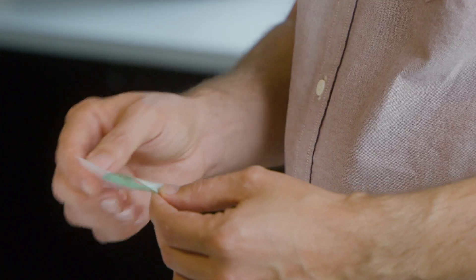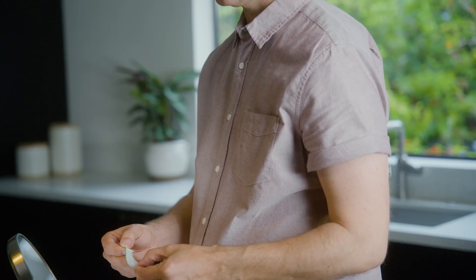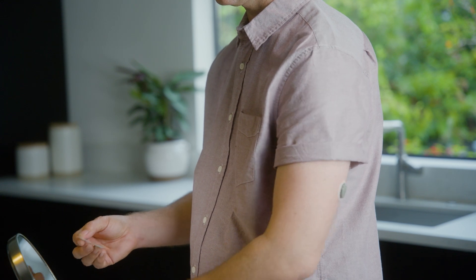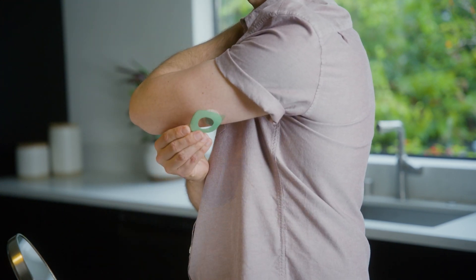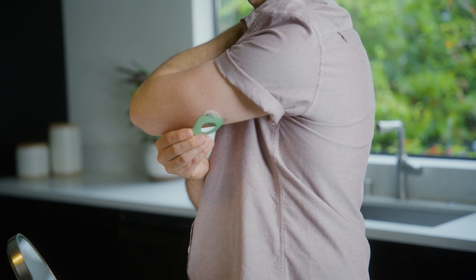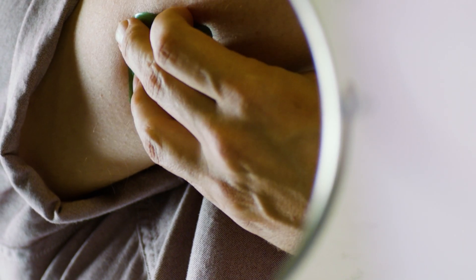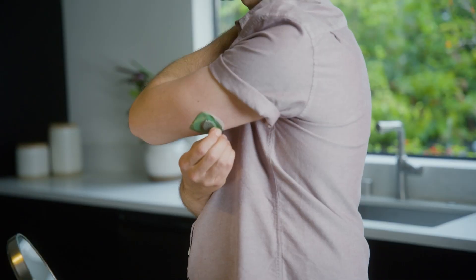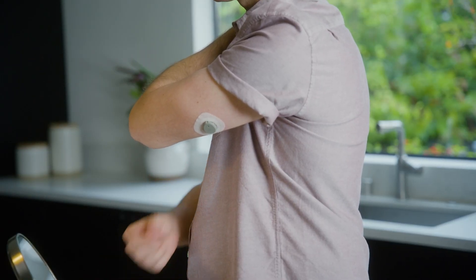To apply the overpatch, first carefully pull off both clear liners one at a time. Be sure not to touch the white adhesive area. Use the tab to place the overpatch around the sensor — you may need to look in a mirror for this part. Once on, rub around the overpatch. Then, use the tab to peel off the liner and rub around the overpatch one more time.